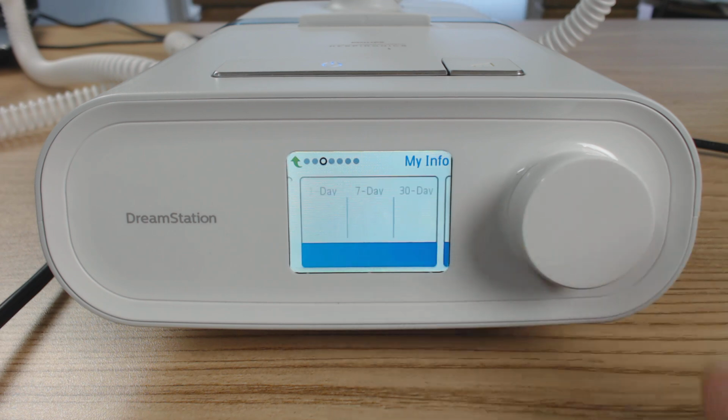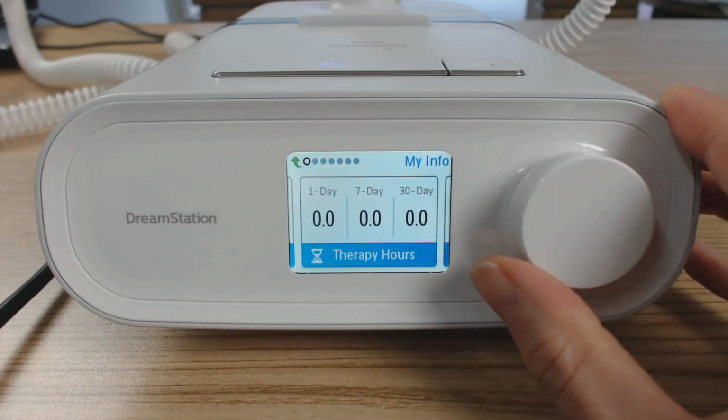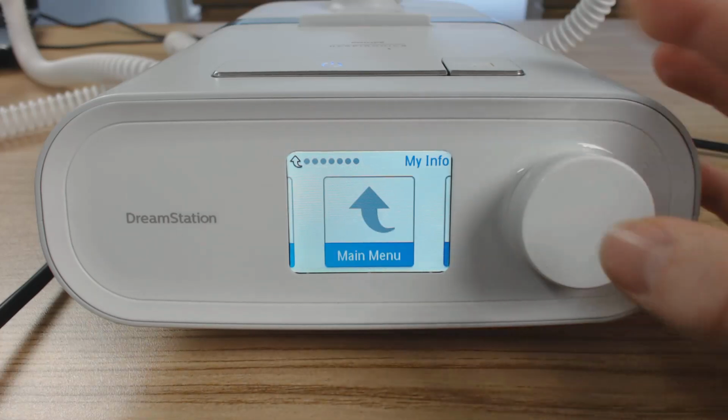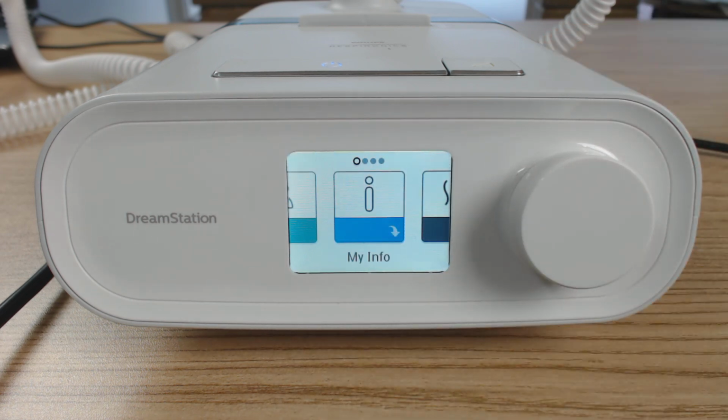We can scroll back, and as you see I'm scrolling back, it's going closer towards this green arrow, anti-clockwise. We get to that, press the main menu here, and it takes us back to the main menu. So that's My Info, mostly data stuff, but it does give you an insight into how your therapy is going, and then enables us later in part 3 to perhaps adjust some of the therapy values to then improve the My Info, if that makes sense.